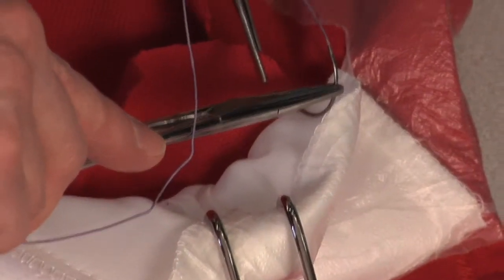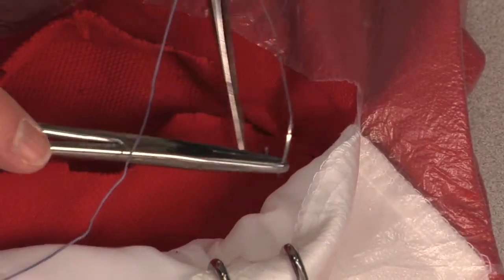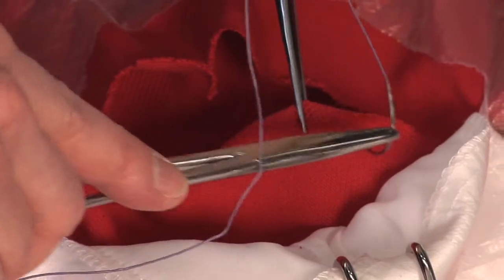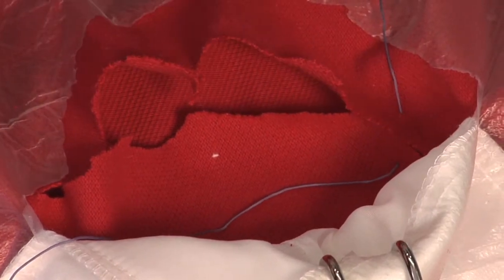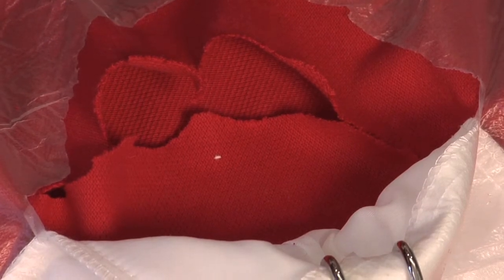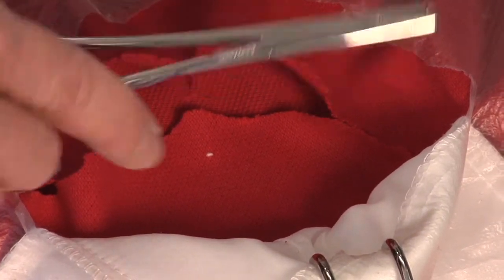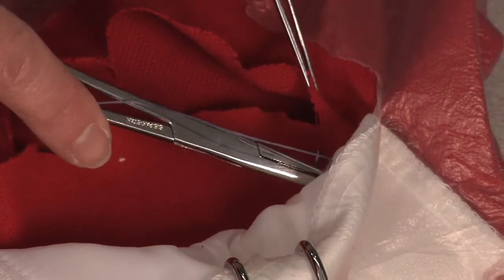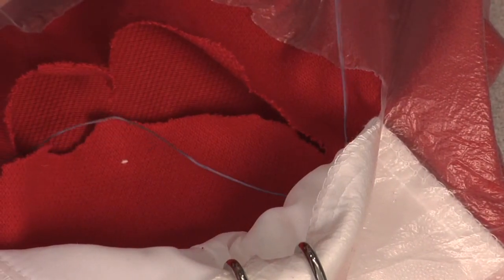When we're talking about a cervical laceration, you want to get just past the corner a bit — you don't want to do it too far out. This is why it's good to have a model: if the learner puts a stitch in the wrong place, not close enough to the corner, you can just say take it out and start again. You can't do that with a real person because there's a hole every place you've put the needle. So we'll get closer to the end and make sure that end is well protected. Okay, it's through — I'm going to turn it.